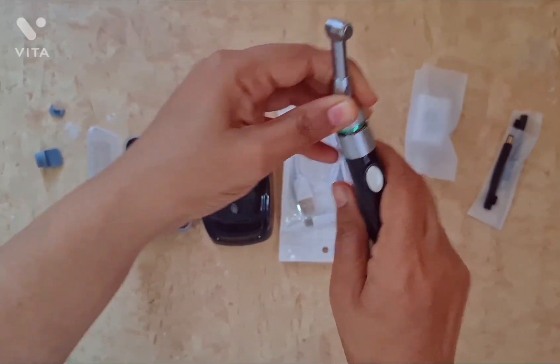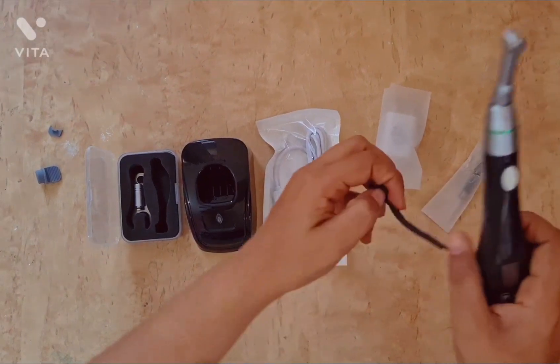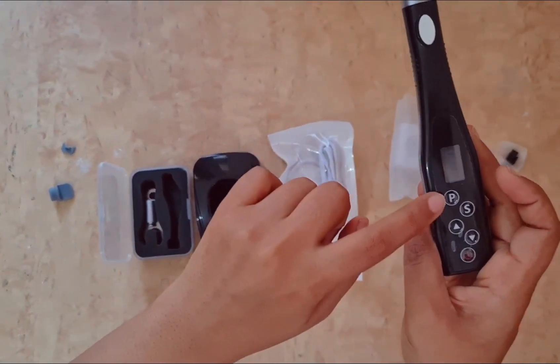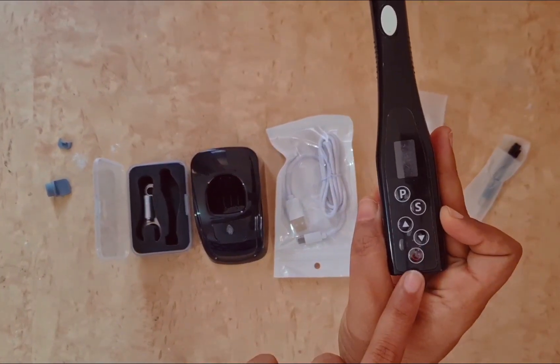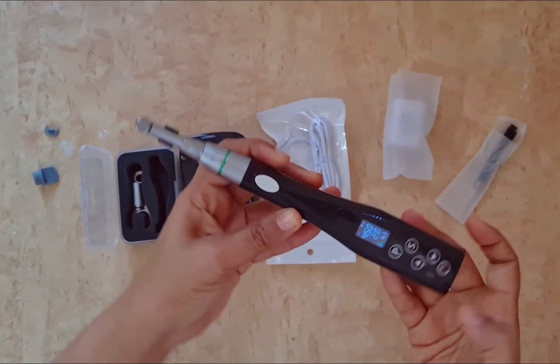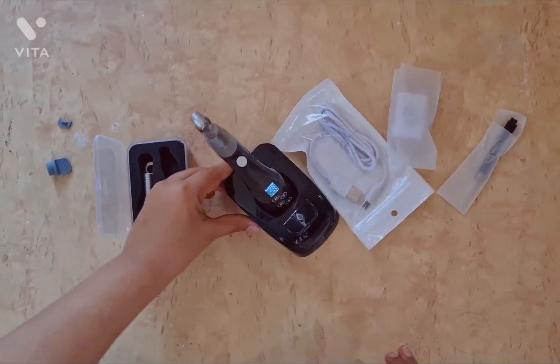This endomotor comes with a six-month warranty. It's a lightweight contra angle endomotor with memory set options. It has a motor switch, LCD screen, program shift key, select key, up button, down button, and power key. With real-time feedback technology and dynamic torque control, it's effective in preventing file fracture. The wide torque and range make it adaptable to the various file systems available in the market.